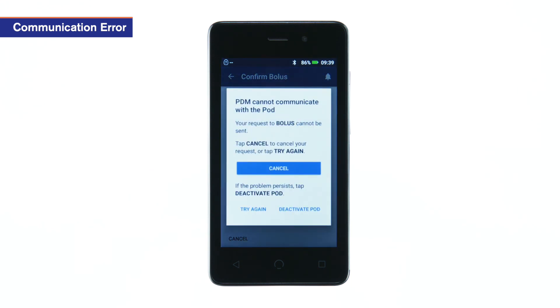If you receive these messages, you may retry your action, cancel your action, or perform a pod change if communication cannot be restored.